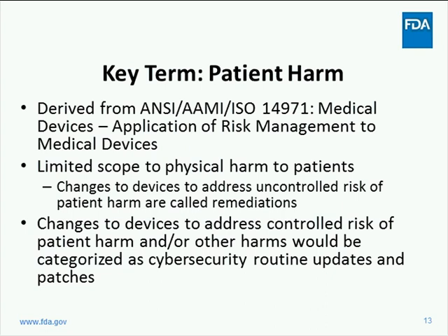As we'll discuss further, the assessment of risk of patient harm is key to determining the appropriate actions by medical device manufacturers, specifically when changes are made to reduce risk of patient harm. And we'll go into this in later slides. However, I wanted to introduce that changes to address uncontrolled risk of patient harm are called remediations and are considered corrections. Changes to devices to address controlled risk of patient harm would be considered as cybersecurity routine updates and patches.